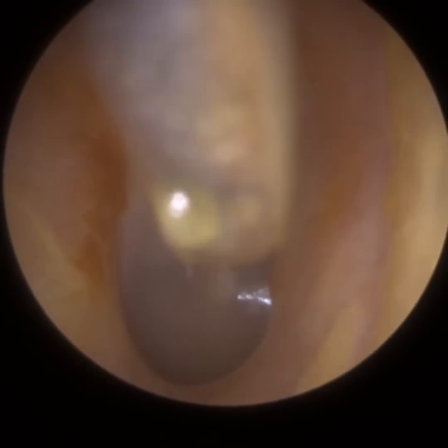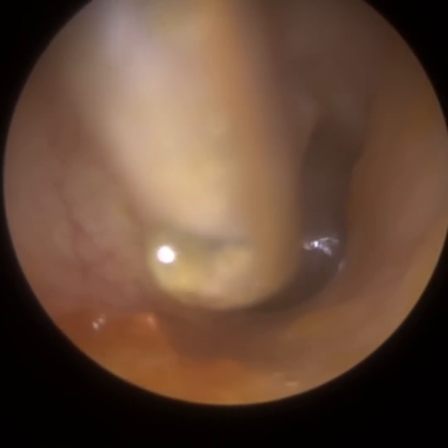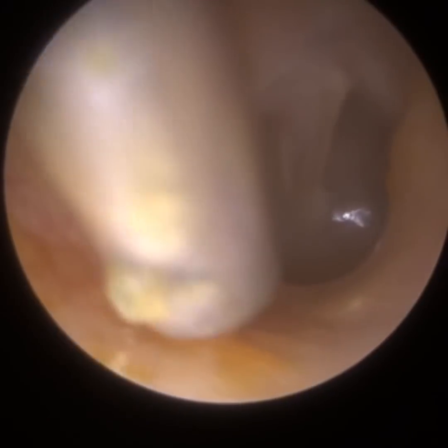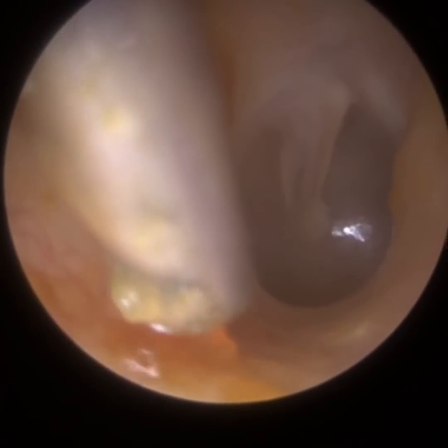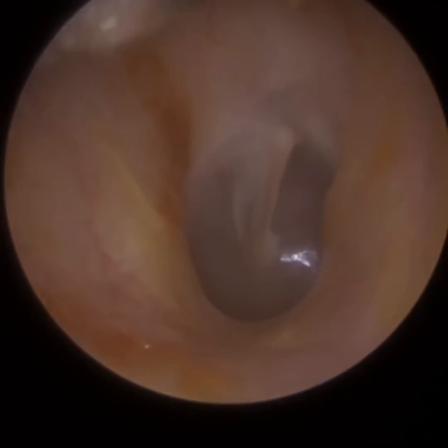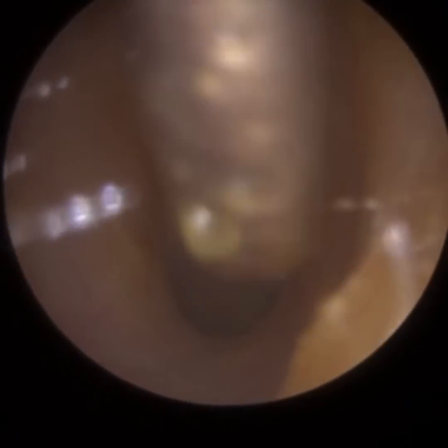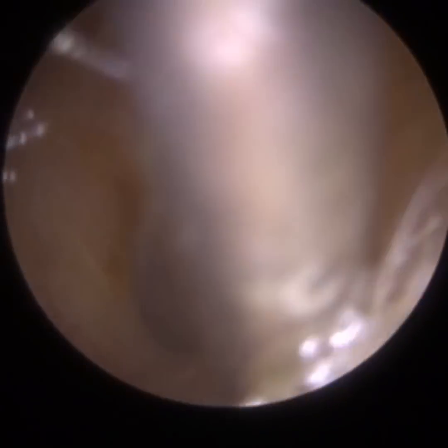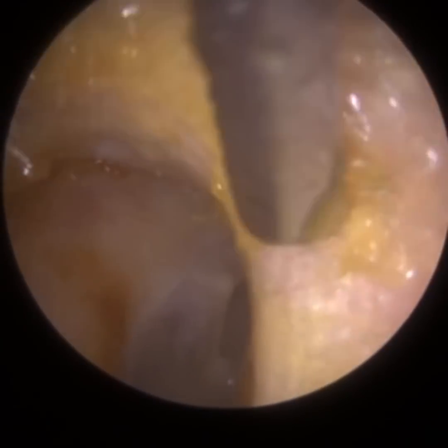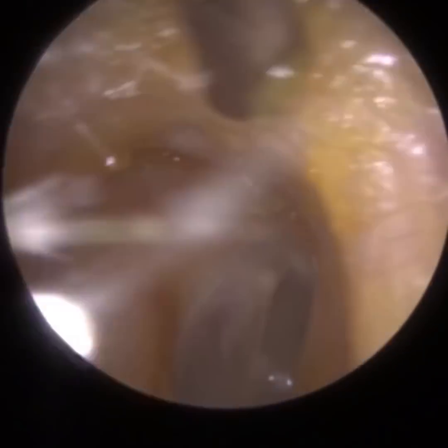Nonetheless, you do it in bits. If you fill the ear with oil, it does get really, really blurry. So it just comes with experience; you kind of know how much oil to put in to avoid that. And you can do it in layers. You can put a bit of oil in, remove the outer layer of the sticky wax, and then go back in with some more oil. So we're just mopping up around the edge, with a fine end suction gauge probe here.